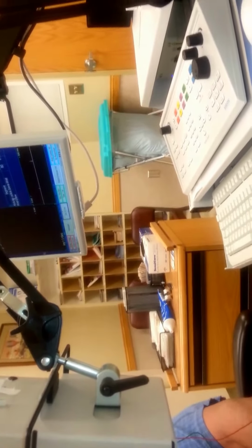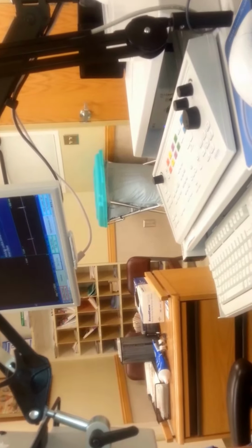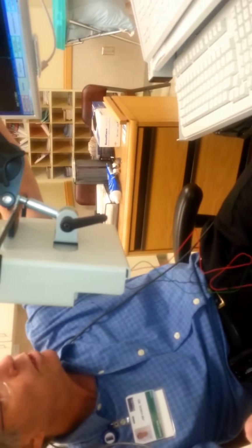Here we go. Here comes the signal. Ow. And that's good. That's a heck of a signal. And it's fast, 2.8 thousandths of a second. Normal is 4.5 or less, and the size is 8.4 millivolts. So far that's fast across the carpal tunnel.